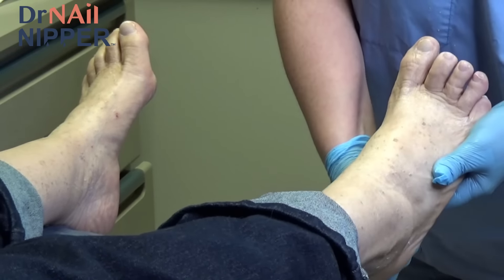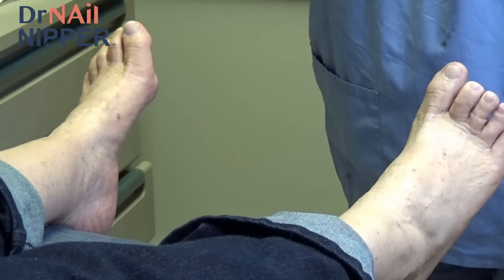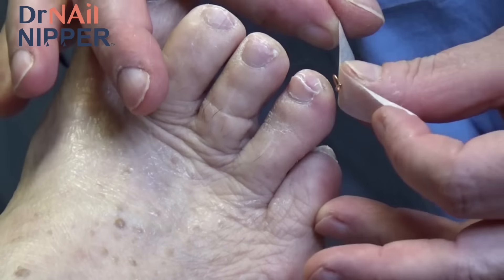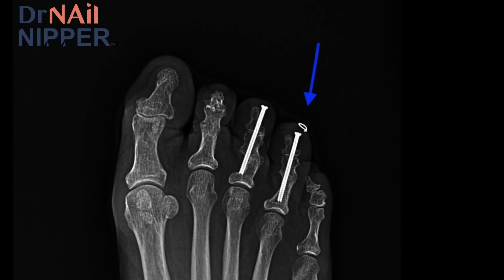That one is starting to go under. We have just a little teeny wire here — we're going to put it right over where that corn is. Then we'll put your socks on and take an x-ray. Right where we put the little wire marker is where the screw head is starting to back out and is pushing against the skin from the underside.